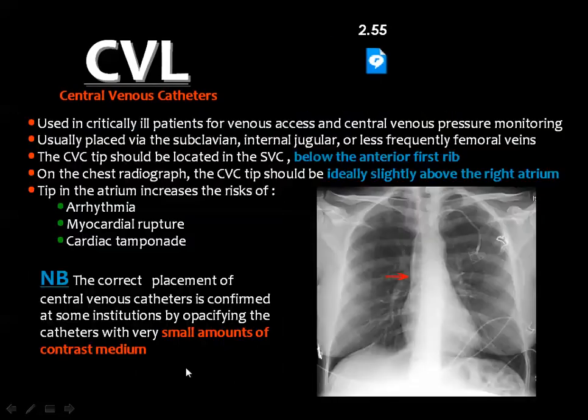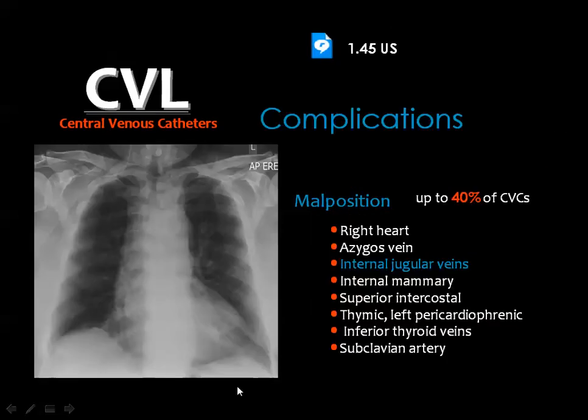One policy, if you have some facilities in the X-ray, for example, is to inject some contrast material through the catheter to ensure its accurate position.